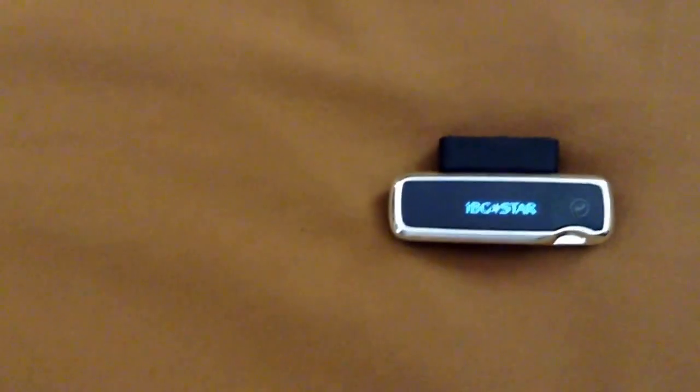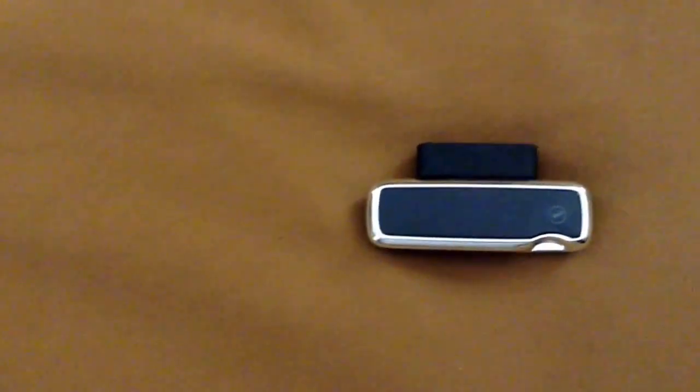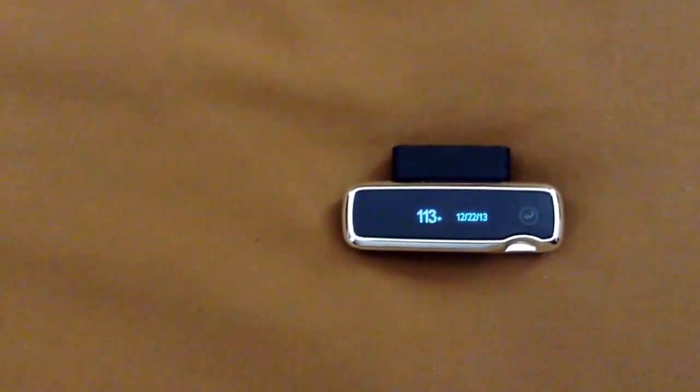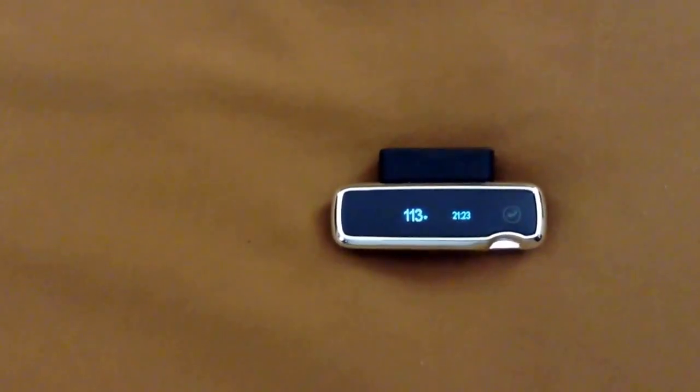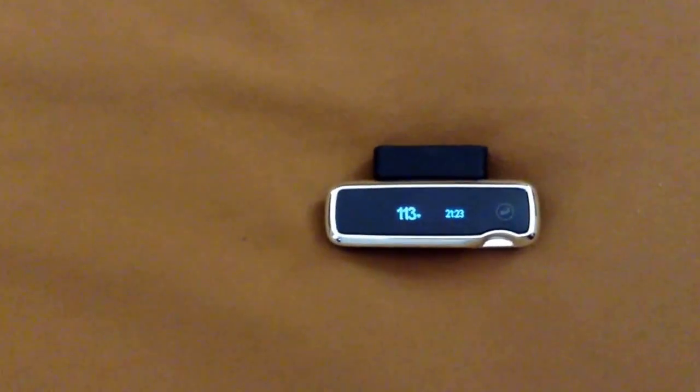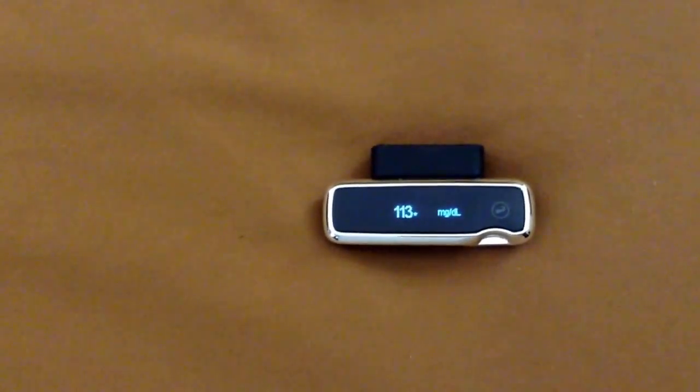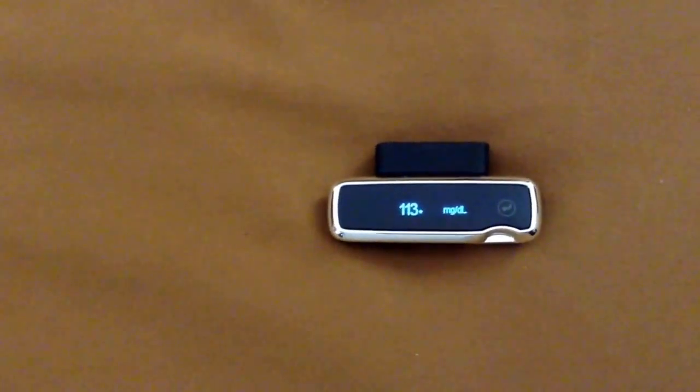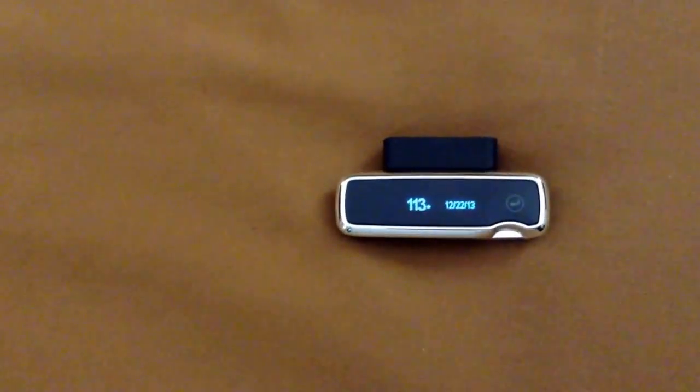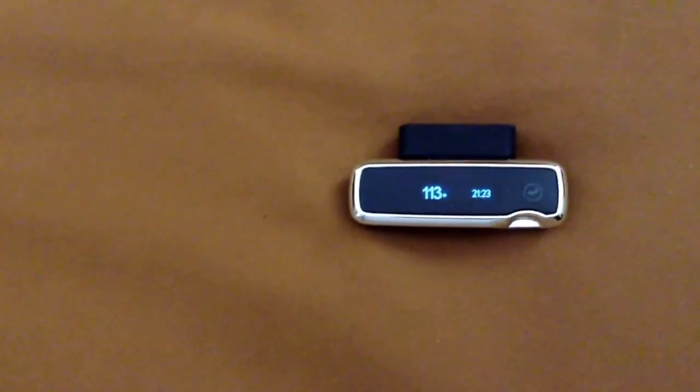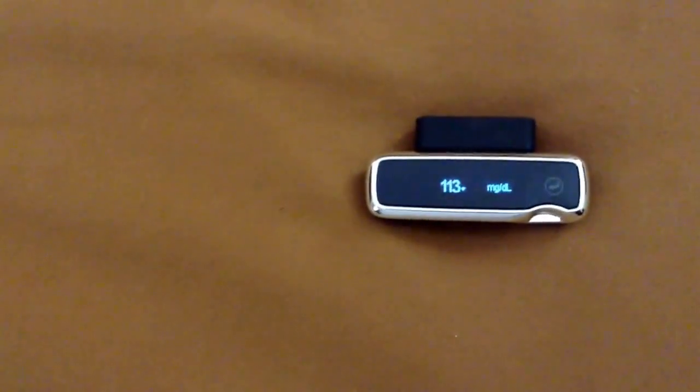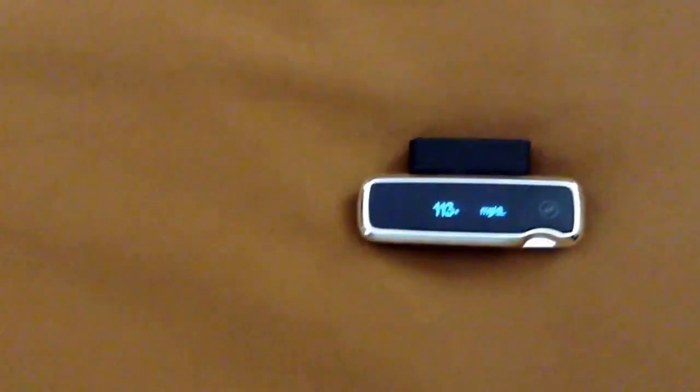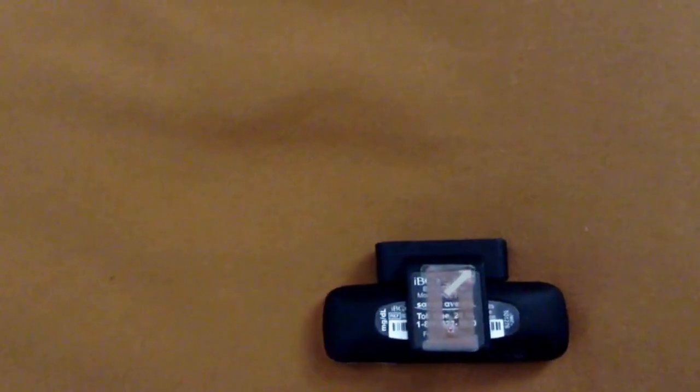When I take my blood glucose, it has a reading on the meter. I have an NFC sticker on the back of the meter, and that's how I send my blood glucose reading to my wife so she knows what it is. There's a sticker right there on the back.